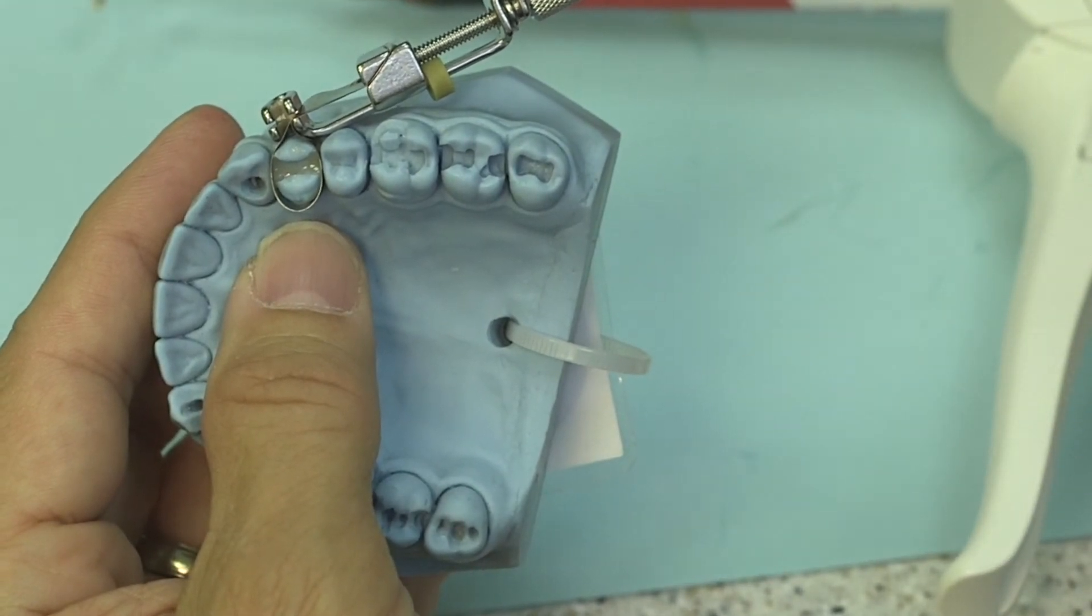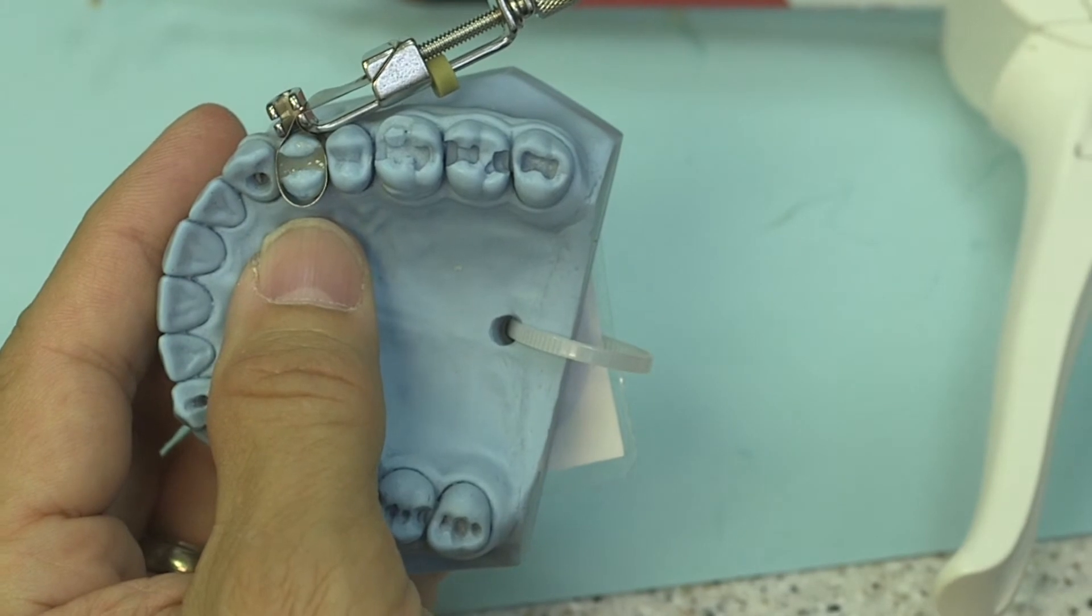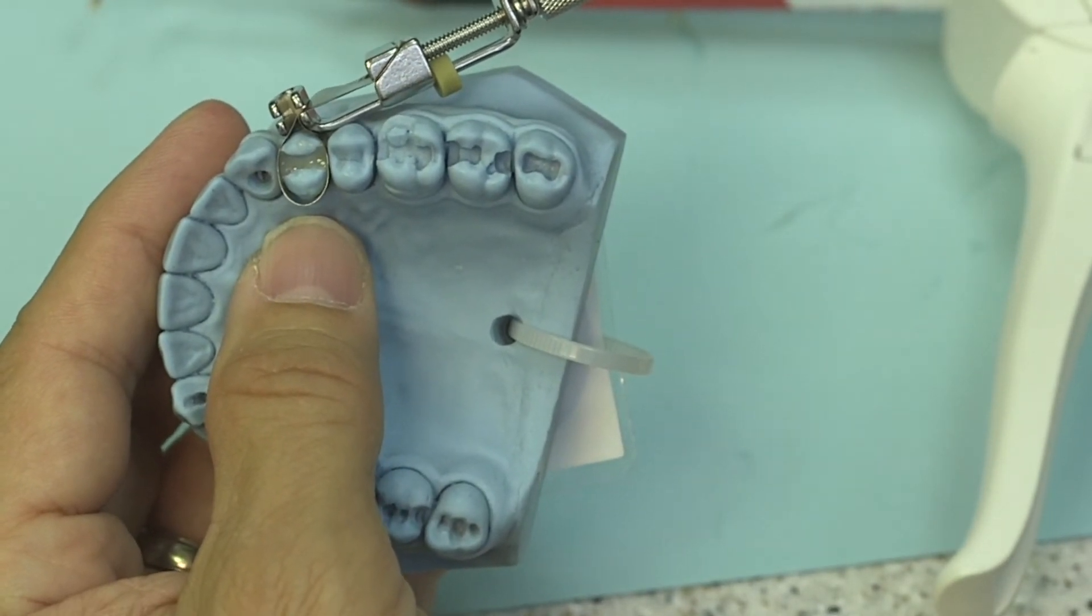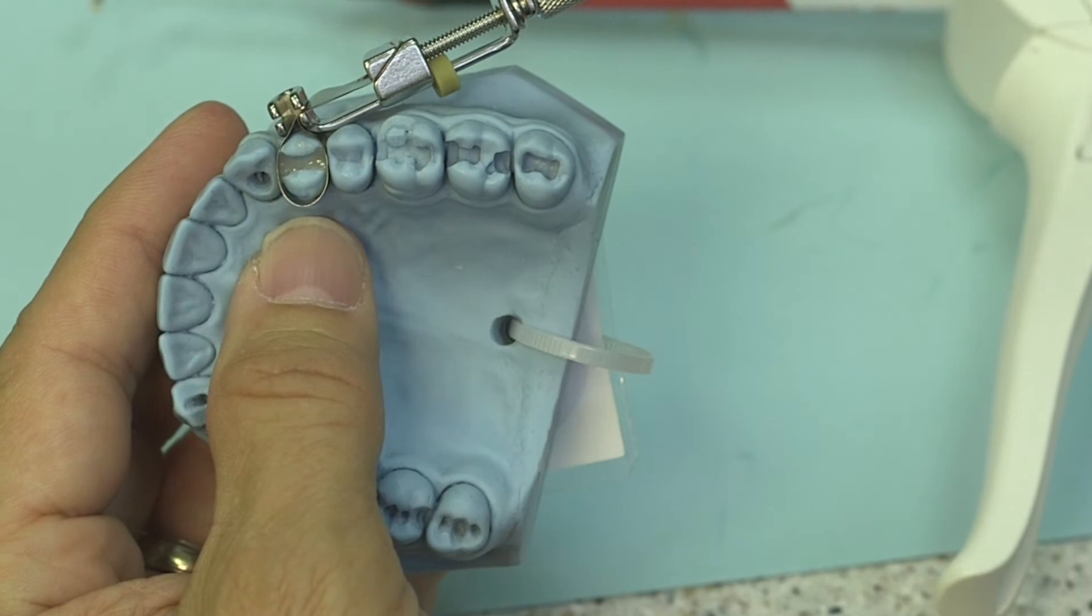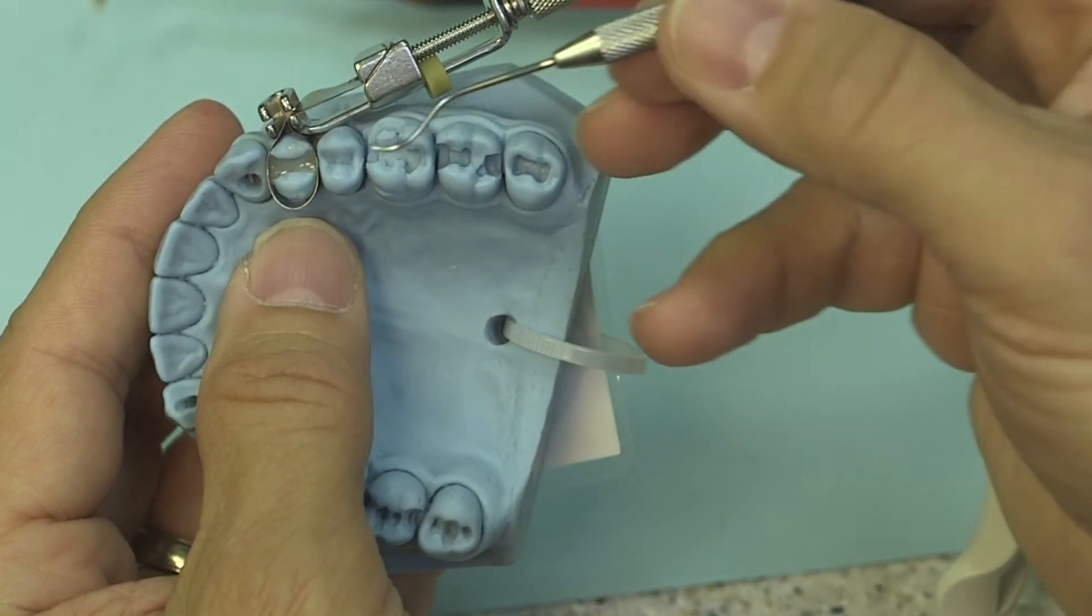As I like to call it sometimes, you're creating a tootsie roll pop: hard on the outside, soft on the inside, and you're not going to really have a full thorough cure. So check your lights, it's going to be very important.